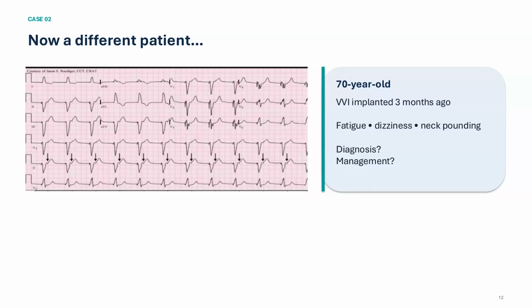But if the patient comes to you in VVIR mode, with paced rhythm in AF at 100, and the lower rate limit you put at like 60, you should adjust the rate response parameter. What will make the pacemaker pace at 100?